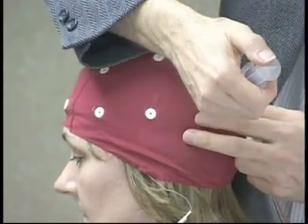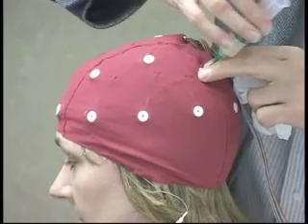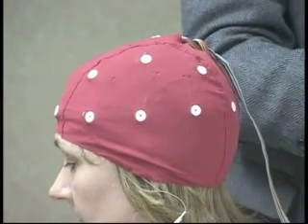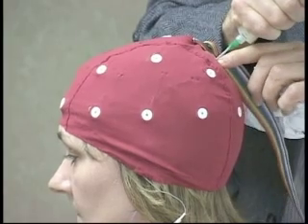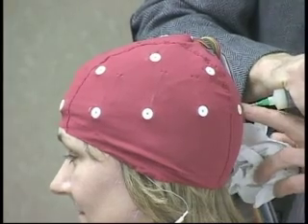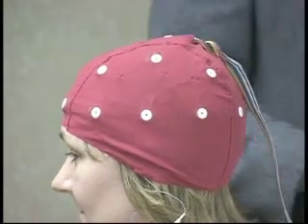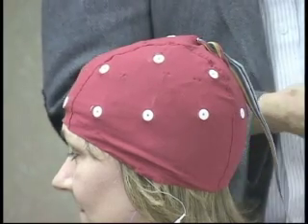So I'm just moving it around like that. Once you get really good at this, you can do this pretty quick. But you may do it quickly and not have a great connection — give this stuff time to just seep in and make a good connection to the hair. We want to keep a sense of calm deliberation, no urgency. Your client's already worried enough that you've got a big needle on their head, especially the kids. They're saying, 'I know that guy's going to plunge at any time now.' That's what they're thinking. And they can smell the alcohol — and that alcohol smell means needle.